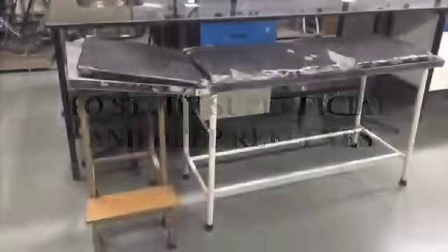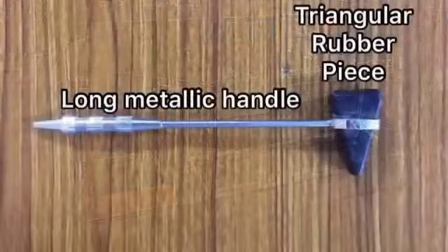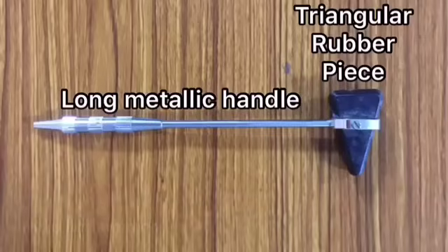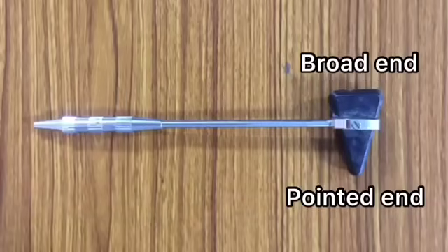To study superficial and deep reflexes, the materials required are an examination couch and a patellar hammer. A patellar hammer consists of a long metallic handle and a triangular rubber piece. The triangular rubber piece further consists of a broad end and a pointed end.